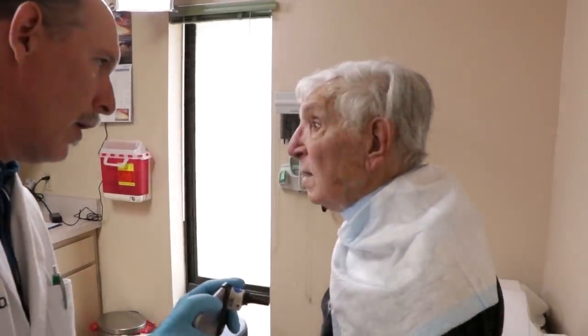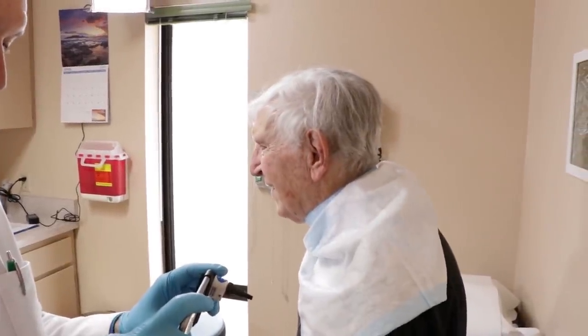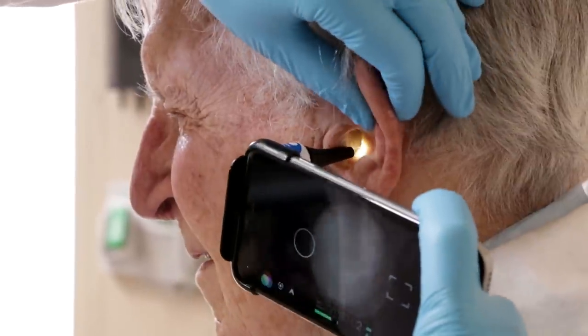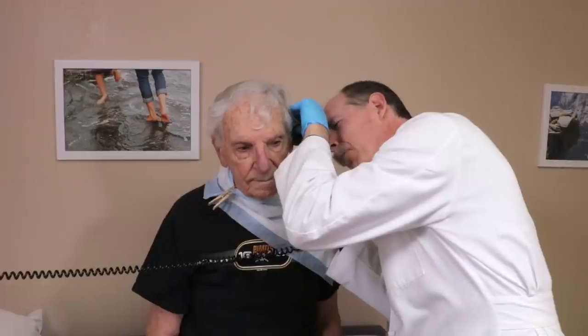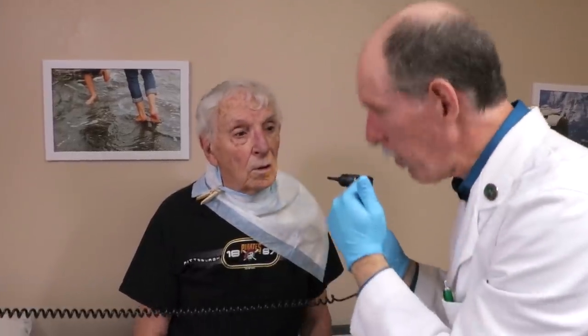Did that hurt? Good — if it makes it work, okay. We're going to take a look in the left ear after one really good flush and find that it really moved the stuff. Plug your nose and blow — okay.